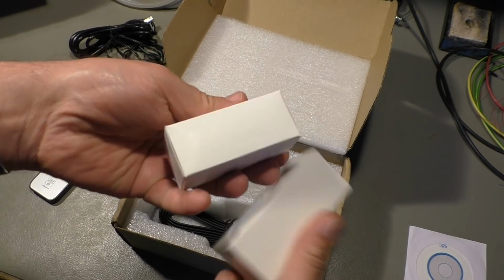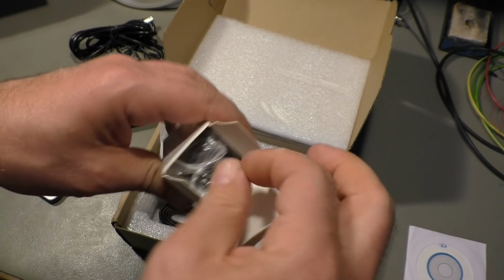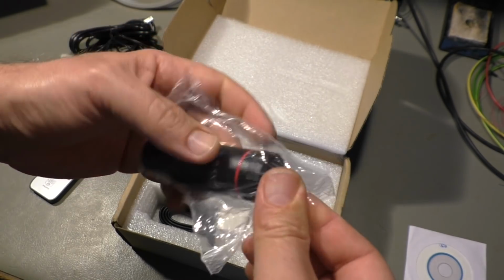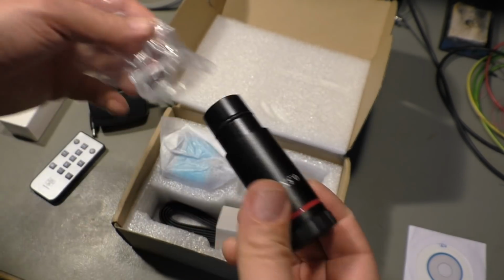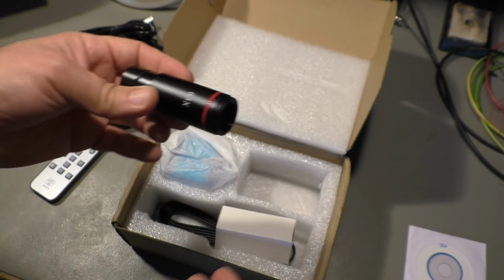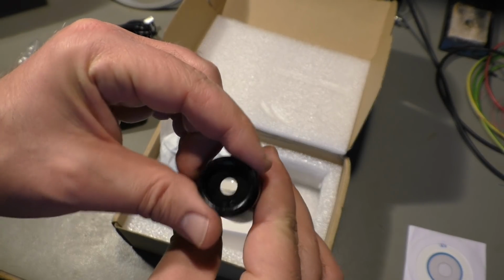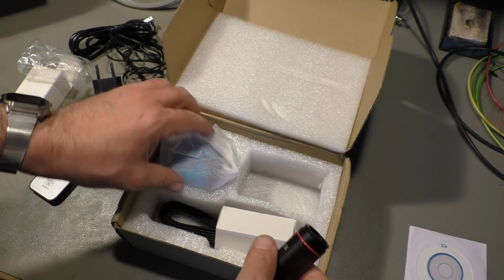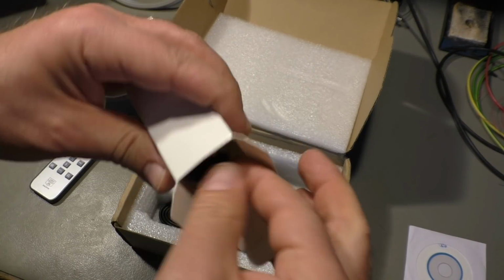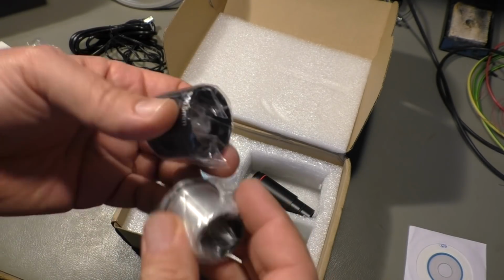Then we have two little white boxes with a lens. A lens. Okay, with a cap that doesn't fit. But we have to unscrew that cap anyway. What's in the second box? I'm pretty sure we have some adapters.